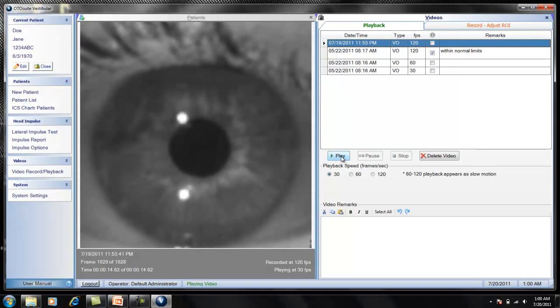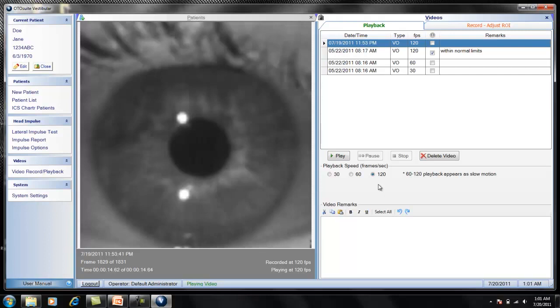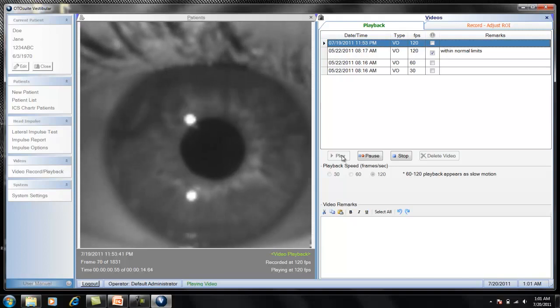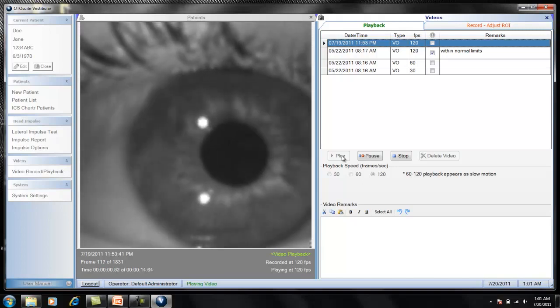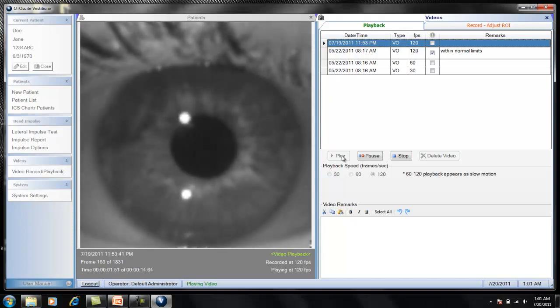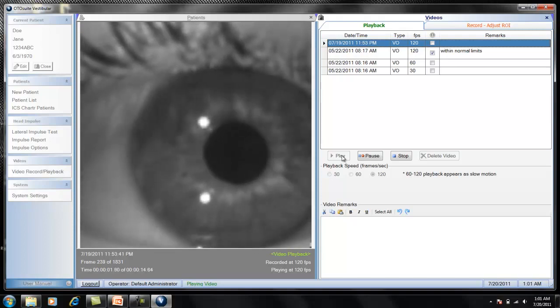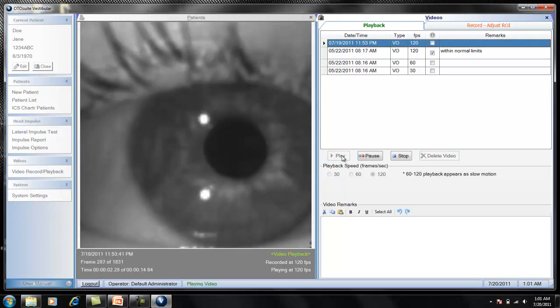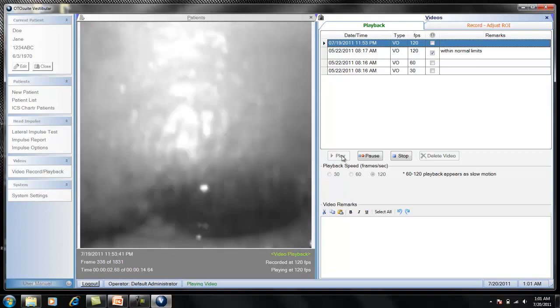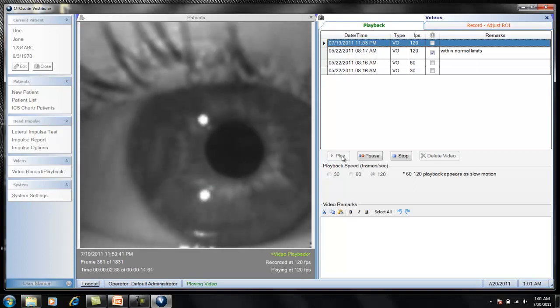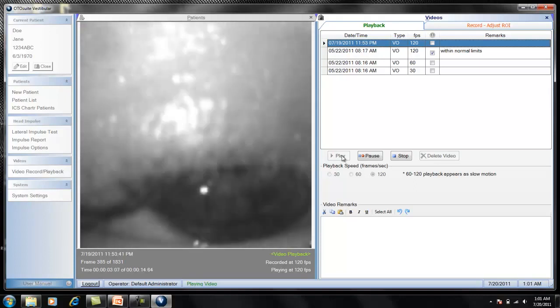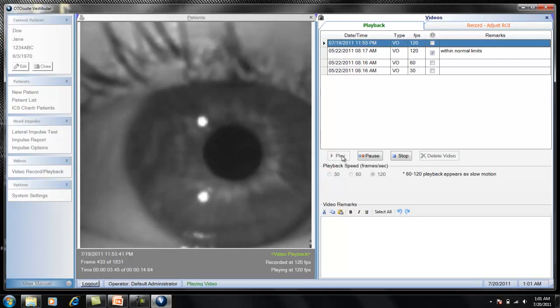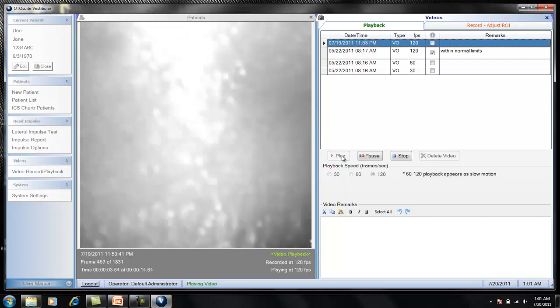Now let's play back that video at 120 frames per second. And you'll see that this is slow motion. So 120 frames per second is going to be the slowest of the slow motion speeds. And 60 frames per second would be in between normal and 120. So you can see that the video is in slow motion.